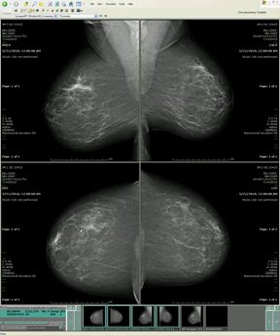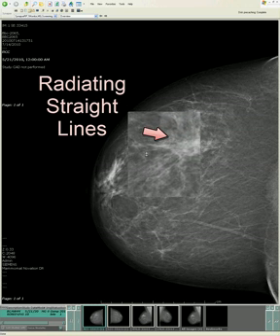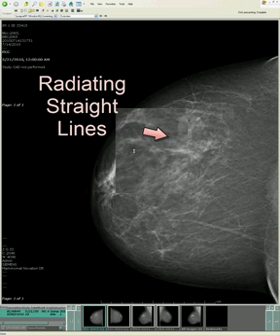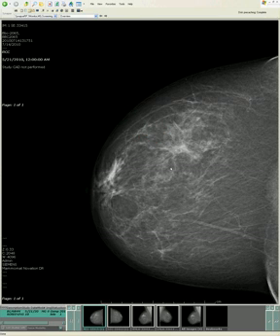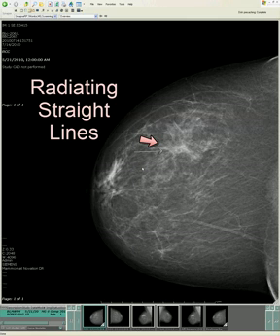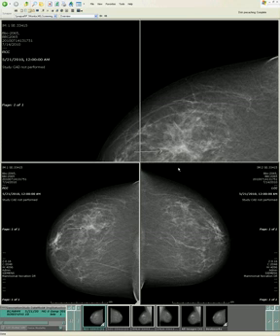Not only that, there appear to be some radiating straight lines — ominous words, radiating straight lines. Let's magnify it and take a look. And sure enough, look at those radiating straight lines. They're all going to a single point right there. This is worrisome. It could be overlying superimposed ligaments, but it's very worrisome because they all come to a point.